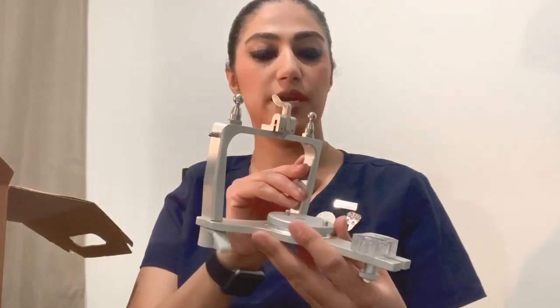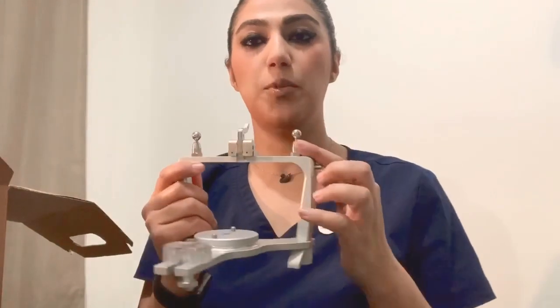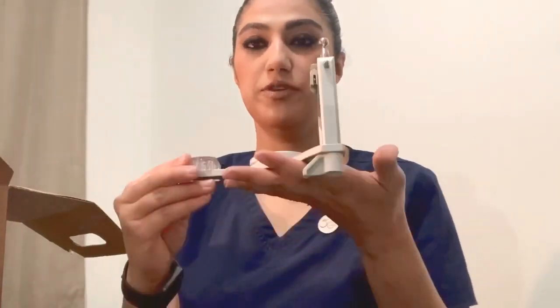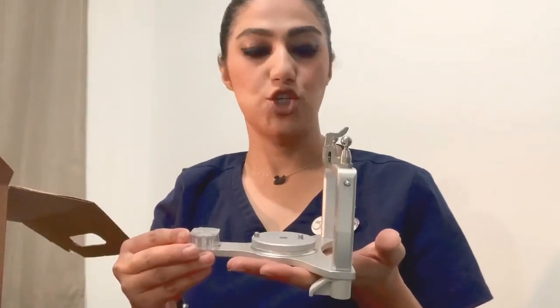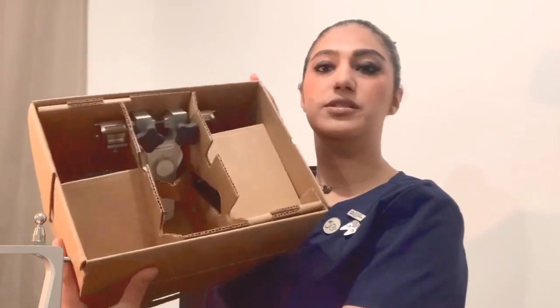This is the semi-adjustable arcon articulator. It shows that the condylar part is located on the lower member of the articulator. The lower member of the articulator represents the mandible of the patient. There is a centric lock here that you can use to lock the upper part, and here is the maxillary part.